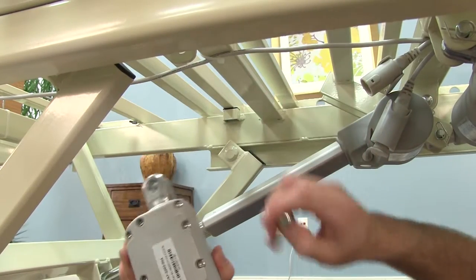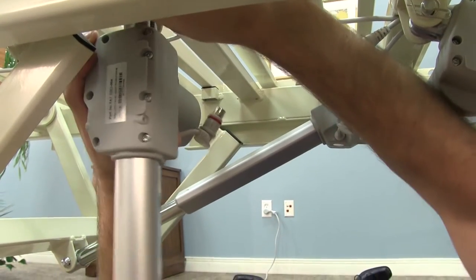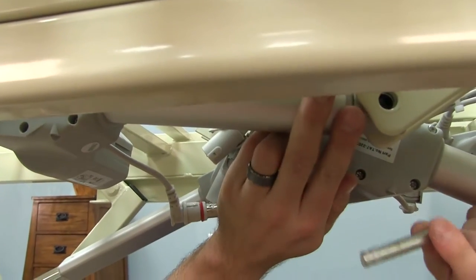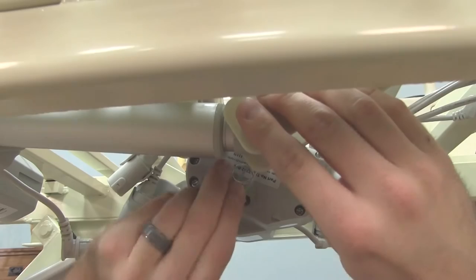Now you can set the old actuator aside and put the new one in its place. Make sure the replacement is positioned in the same way as the one you removed. You'll then reconnect the actuator using the pin assemblies, starting with the clevis pin and then the retaining clip.